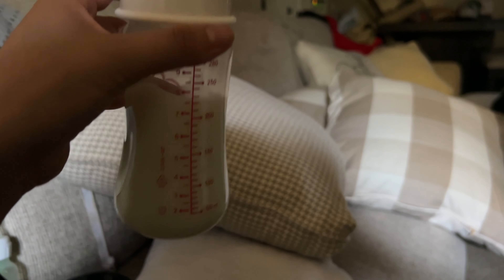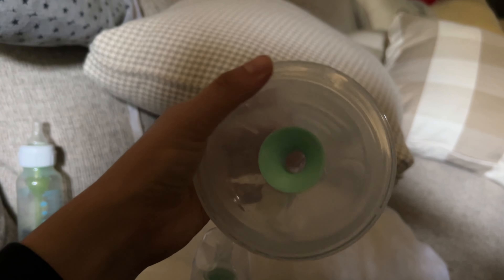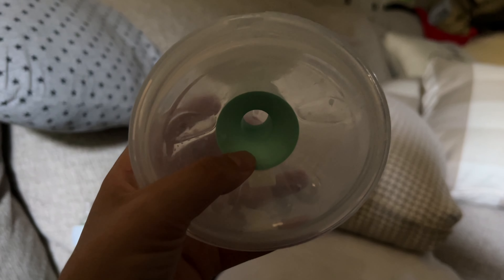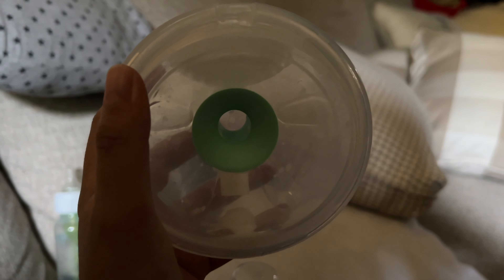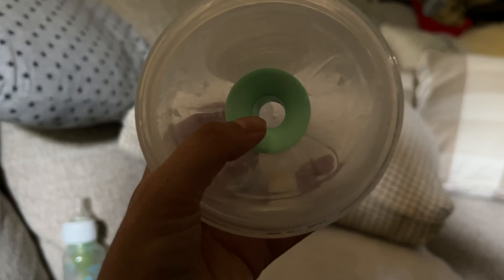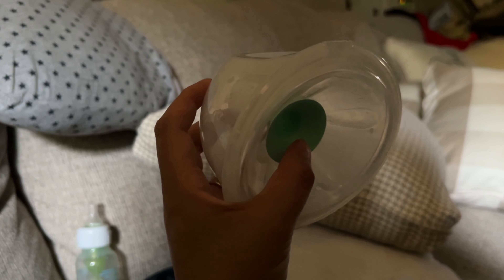For today's morning pump session I got seven ounces on the right and six ounces on the left. I used the flanges I ordered from Amazon instead of the BioBoo flanges, and it made pumping a lot easier — no pain, very comfortable. I was able to get 13 ounces this morning, which is better than yesterday when I used the BioBoo flange adapter and only got eight ounces. Normally I don't get that low unless my supply drops around that time of the month.